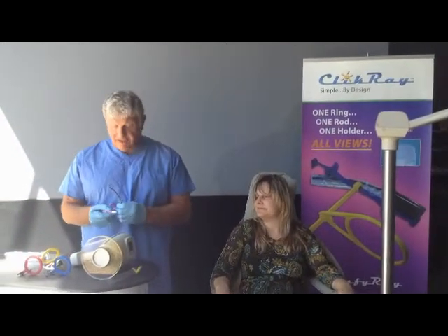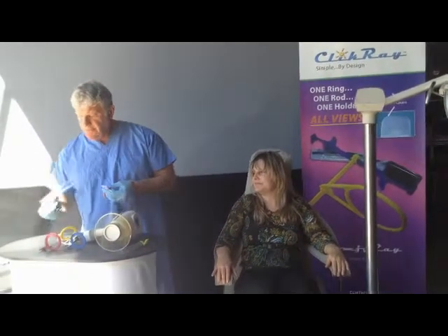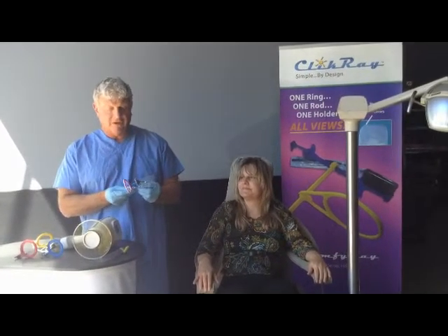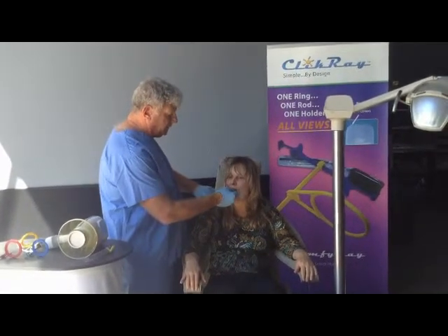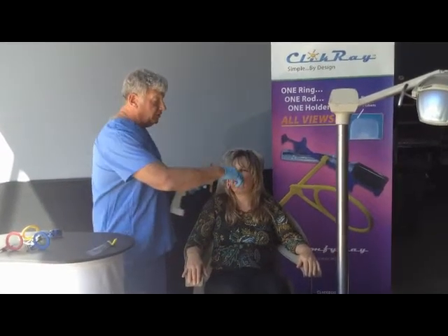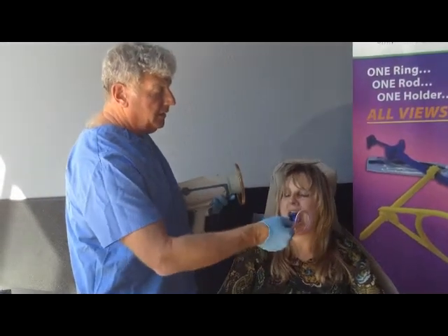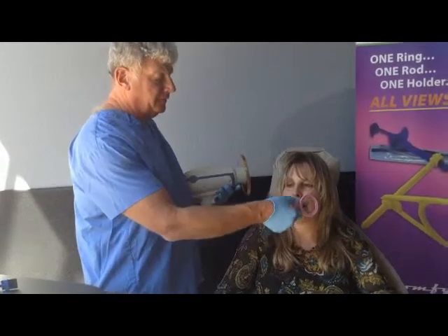Last but not least, we have bite wings. For the bite wing, we just place it on the short side and turn our ring over to the other side, have the patient close down. See how close we're going to get? We just move that in as close as possible. We take our bite wings on this side — open please. Take our bite wings on that side — open please.